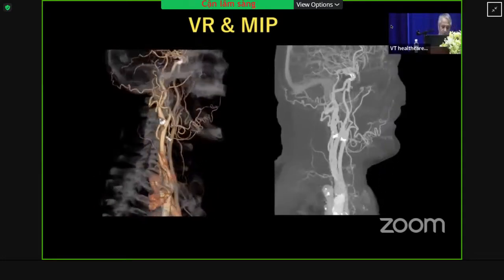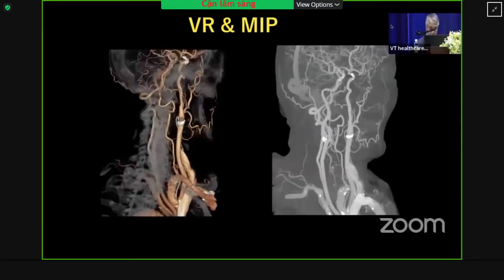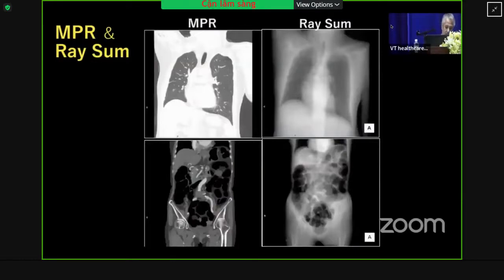Images are provided according to each application. Shown are MPR and RaySum images. When RaySum is processed by using the average value in the projection part as a signal value on that ray, it becomes an image like a simple X-ray image. Since MPR is to display a certain cross section in 2D, the display contents are different even if they are in the same direction.